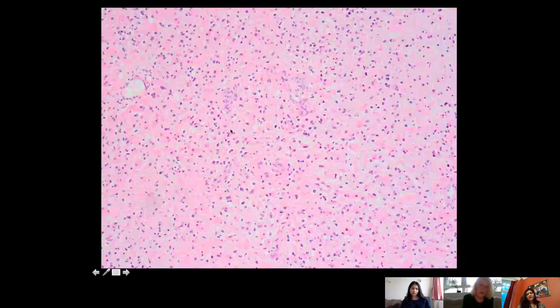And here is still very mild, very focal. Also remember, this patient underwent radiotherapy, so there are also radiotherapy-related changes of the blood vessels. That's, for example, the thickening of the blood vessels. Here, this could be treatment-related. And here, more convincingly in this capture, here the cells show clear-cut astrocytic morphology with abundant eosinophilic cytoplasm, what are often called gemistocytic astrocytes. And we also see more convincing microvascular proliferation with multi-layered endothelium.